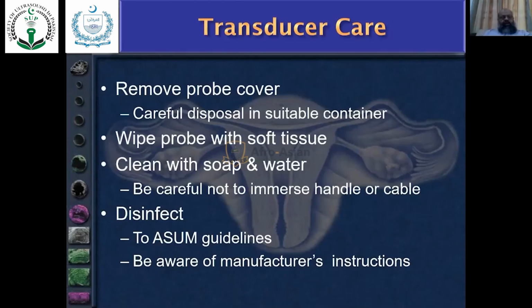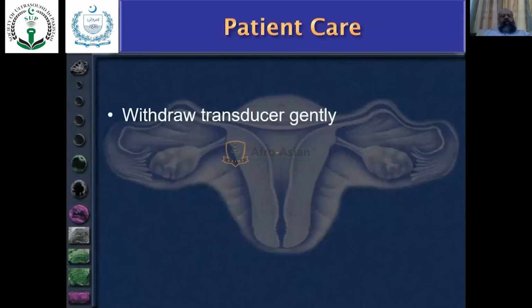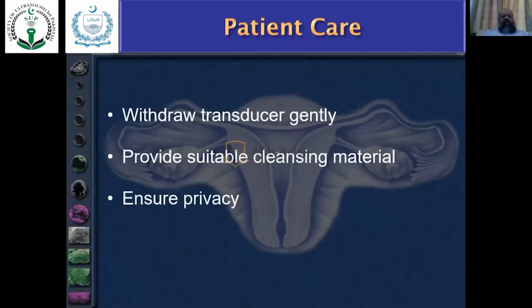They have given guidelines, but be aware of manufacturers' instructions about disinfection also. Withdraw the transducer gently, provide suitable cleaning material like tissue papers. Ensure privacy if she is changing the gown.